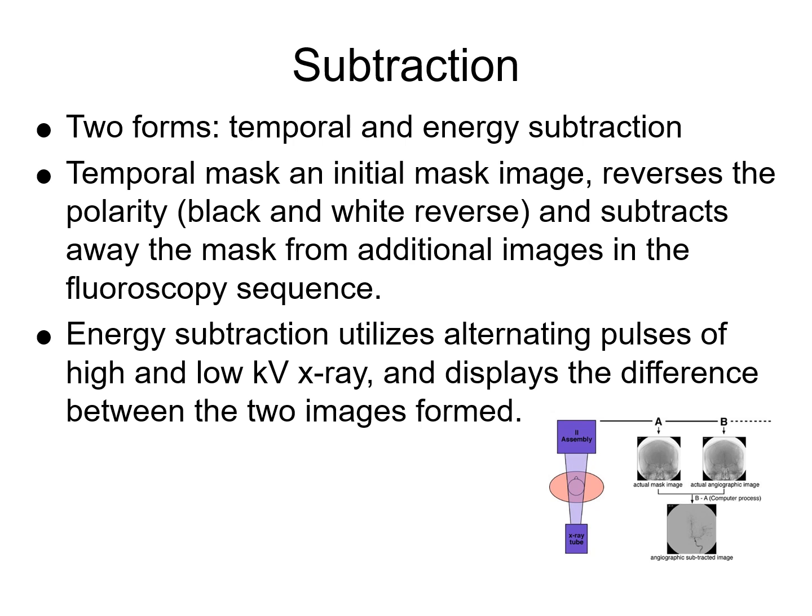And so what we can do is basically take the grayscale and swap it with the intensity scale. So basically resave the thing as a negative polarity image, where everything that was colored black is now colored white, everything that was colored white is now colored black. You see this a lot when radiologists run fluoroscopes. You might notice, hey, that barium looks black. That's weird. Well, no, they've reversed the polarity. They've done the software swap and reversed the polarity of the image, okay?